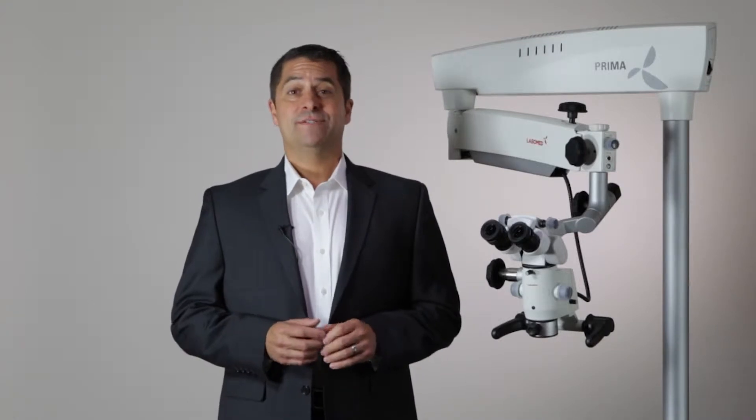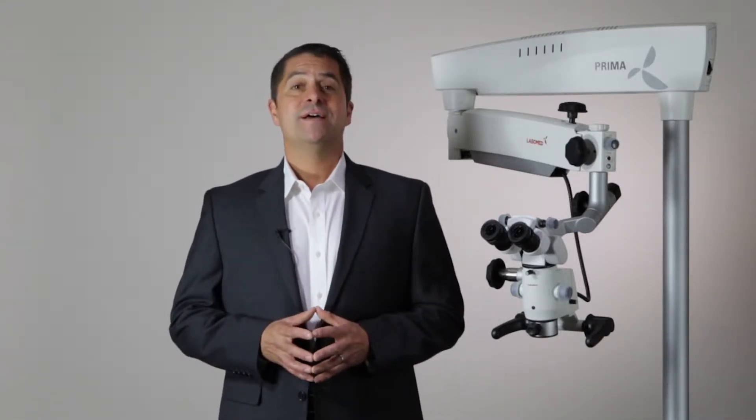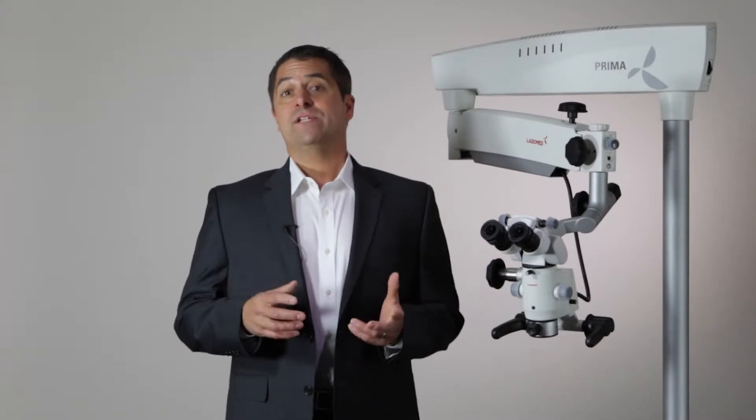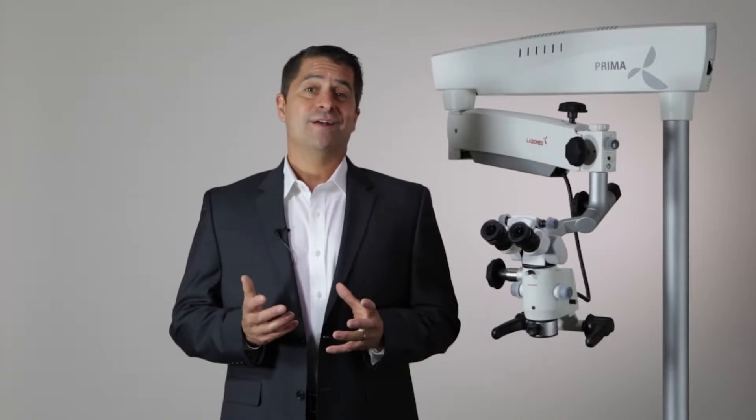Hello, my name is Dean Horstman, sales manager for LaboAmerica and LaboMed brand surgical microscopes. I'm here to discuss with you the range of optional accessories for the Prima microscope, which we call the ProLine.